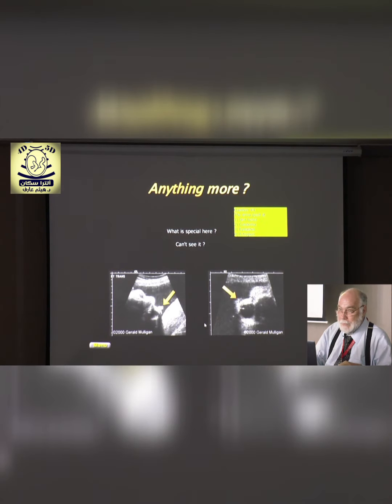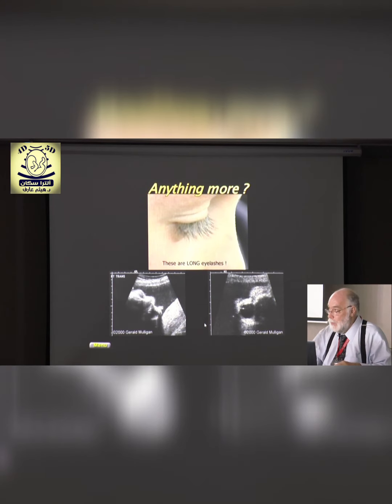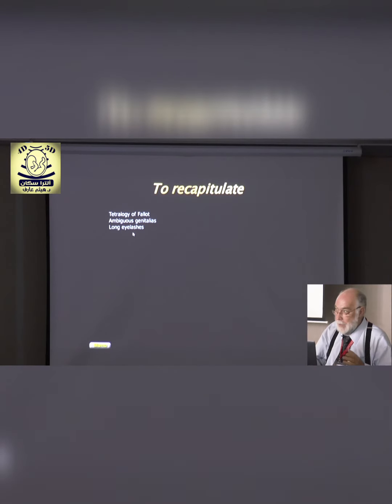What is that? Eyelashes, very good. These are long eyelashes. When you scan, you look for eyelashes. When you look for the eyes, you look for the eyelashes. So, is it a big deal to have long eyelashes? Most women like to have long eyelashes, huh? So, not a big deal.